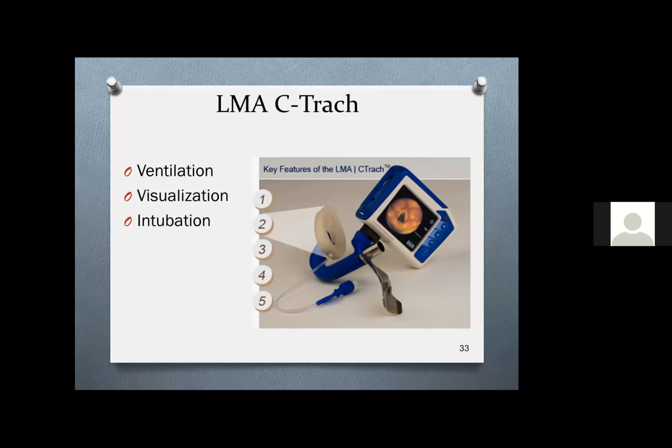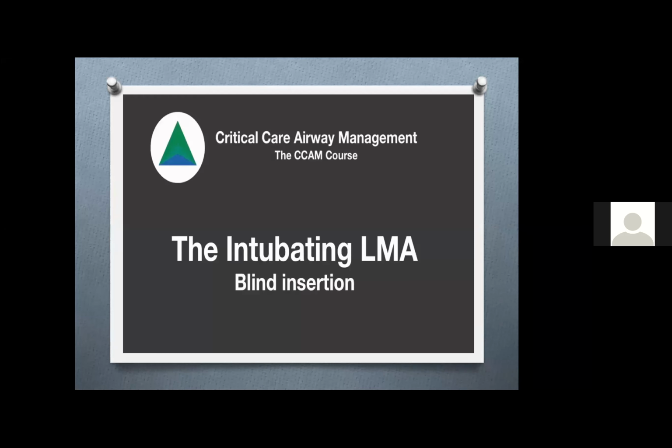The C-Trach, it's like the intubating LMA, but with a video camera. So it makes it nicer and more beautiful to see where the tube is going when you intubate. I'll give you just an example. It's a 2 minute video.